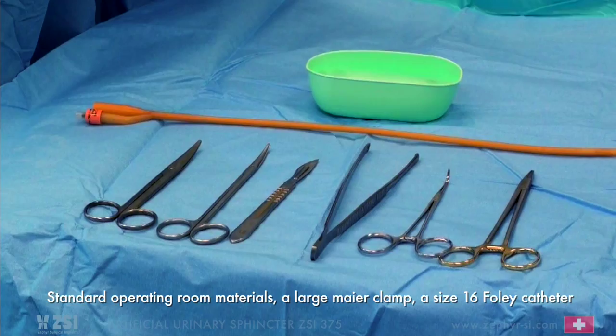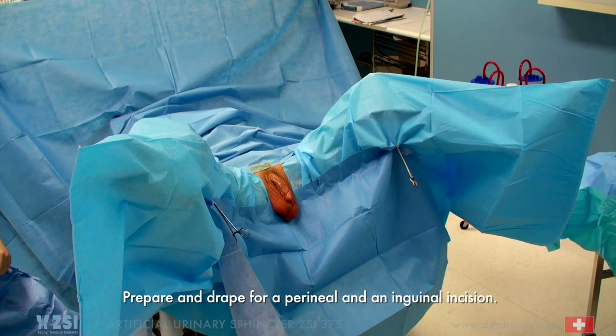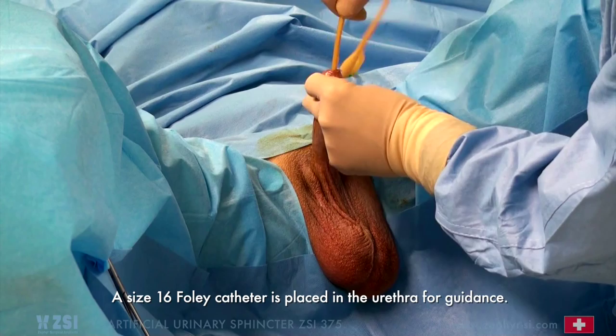Artificial Urinary Sphincter ZSI-375 — Surgical Procedure. Standard operating room materials include a large Meyer clamp, a size 16 Foley catheter, sterile normal saline solution, and containers. Prepare and drape for a perineal and inguinal incision. A size 16 Foley catheter is placed in the urethra for guidance.